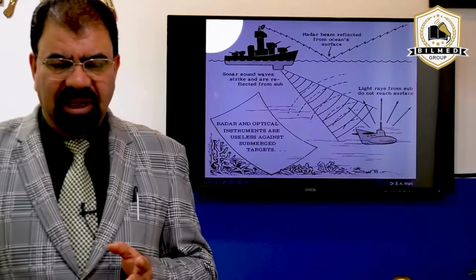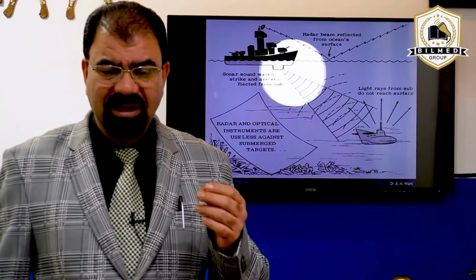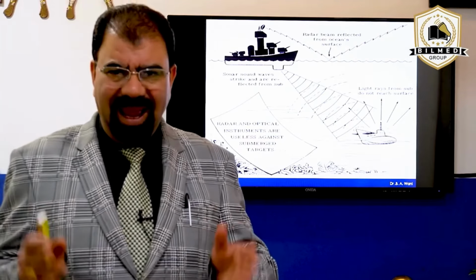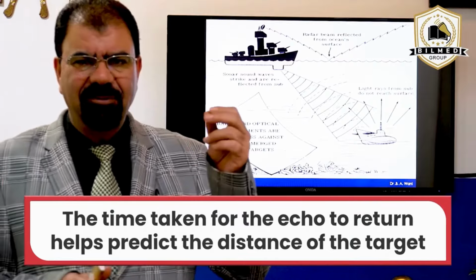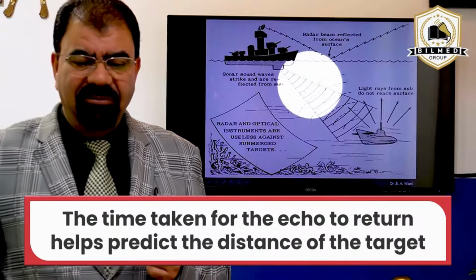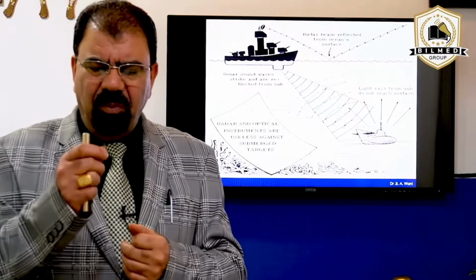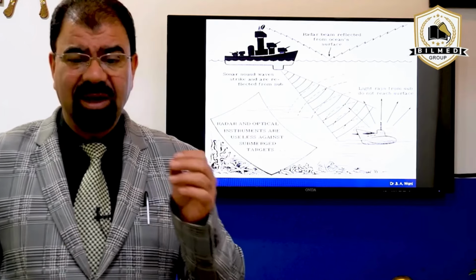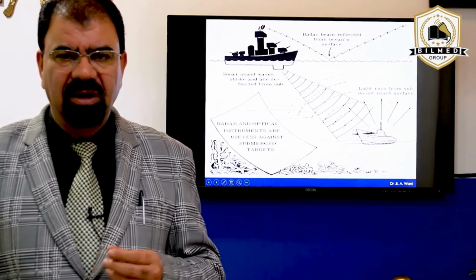So they calculated the time when they sent and when they received. Sending and receiving lead to a lag, and the lag tells how far the target is from my point. Number one. Number two, they calculate when we sent and when we received, and that way they pinpoint where the drowned submarine is. So using this pulse echo technique, we located the drowned submarines in World War II.